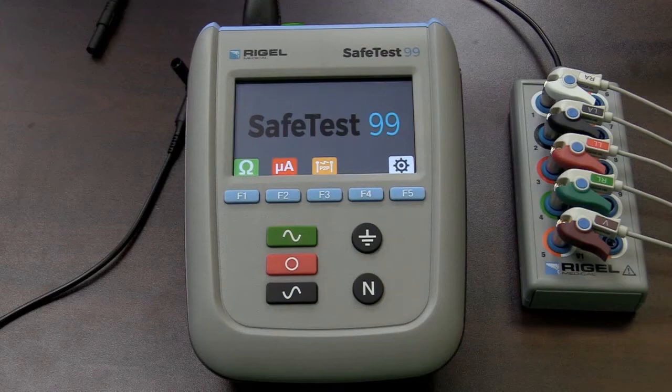F2 with microamps displayed is where we'll do all our leakage current measurements. F3 with the point-to-point is simply where we will do point-to-point measurements, and those measurements are done where the device under test cannot be plugged into the socket for the device under test on the SafeTest 99, but that device is hardwired into the power source of the facility.